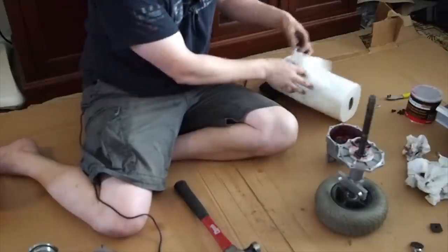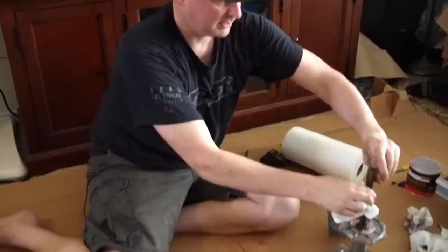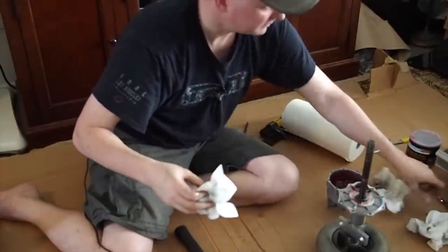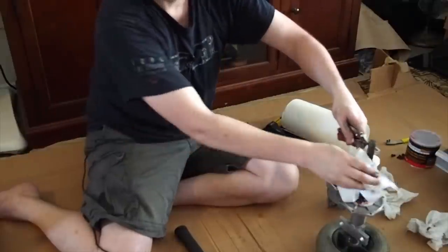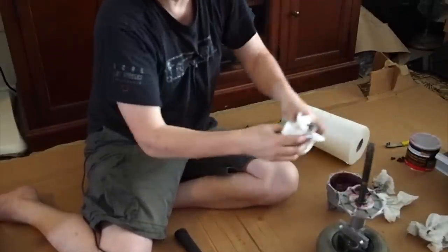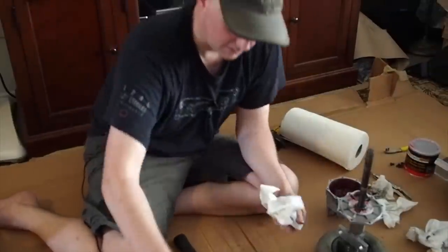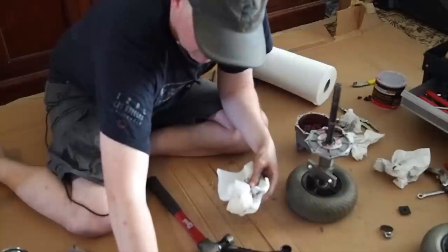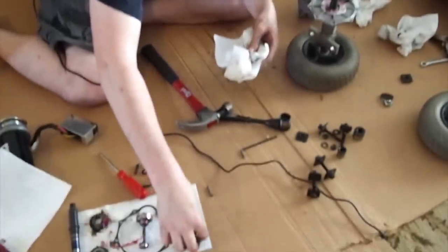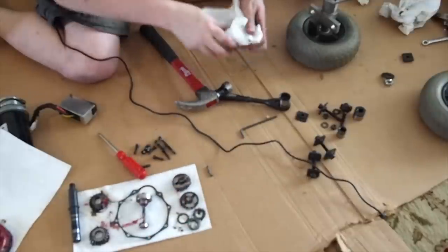There will be a lot of paper towels involved in this. I don't want to really ruin this, but there we go. So this pin goes into that one there. And I just wanted to get this washer here off. So I have three washers. And the funny thing about these washers is that they're all different sizes. So these are the three washers.